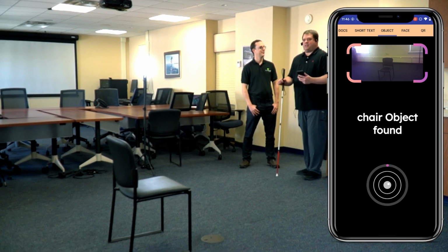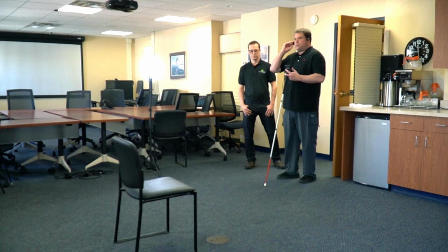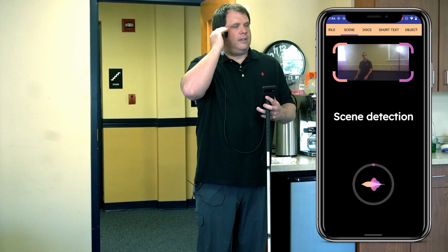All right, I give up. Oh, okay. I got a beep. That's good news. Now, oh, it's really beeping. Now the question though is: is there anyone sitting in that chair? We don't know. Let's quickly jump to scene mode and see if maybe it tells us if somebody's there. Face recognition. Idle. All right, there we go.